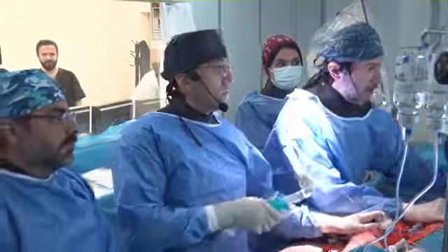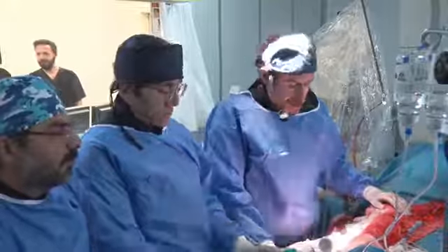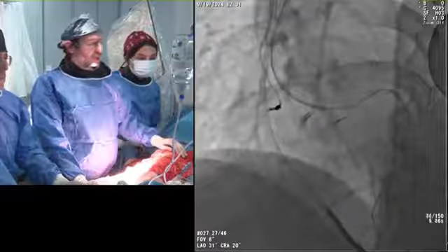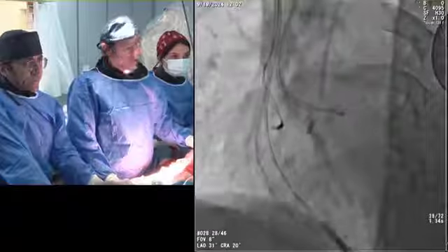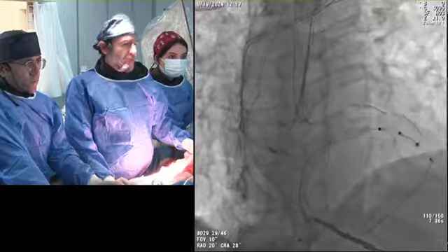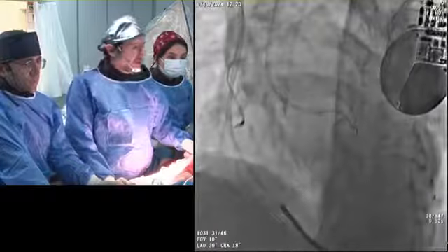Yeah, okay, Bektaş, we are finished, but there are some remarks I would like to express here. So, geri gel. Haldun's advice was good. We lost our position with the RG3, okay? So then we had to snare again. Next. This time I used an R350. I took it from my Magic Pack. It helped us a lot because it didn't have the friction, and it was easy to snare because it was free inside the microcatheter.